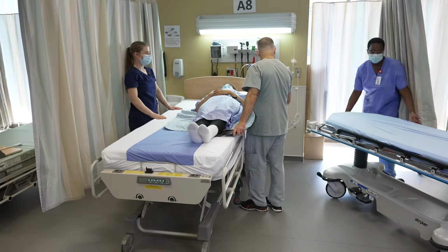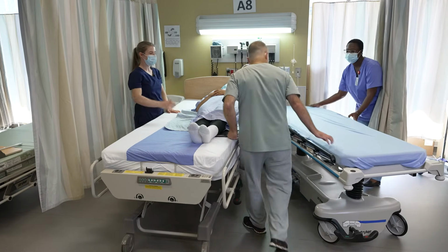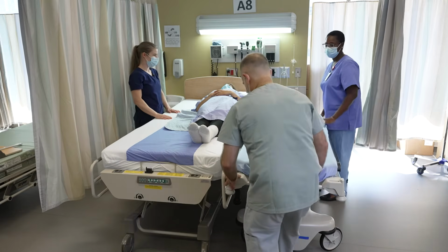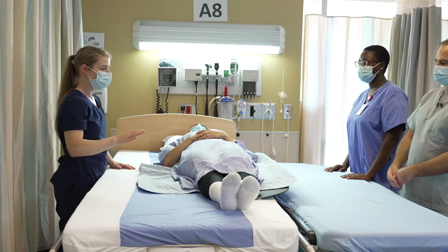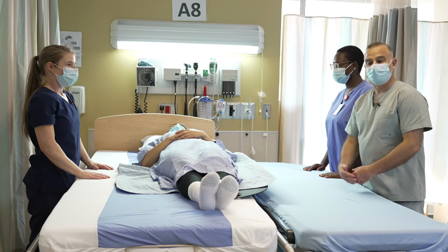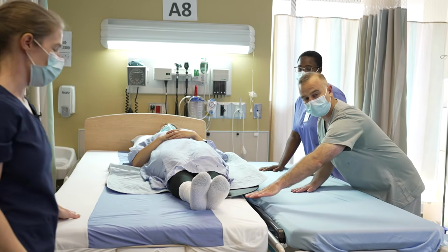So now we're going to bring the stretcher forward, making sure that someone is close to the side of the bed to not leave the patient unattended and decrease risks of fall. So now, as you heard, the brakes are on the stretcher as well as on the bed. To transfer Mrs. Gendron over to the stretcher, we need to ensure that the stretcher is slightly lower than the height of the bed.